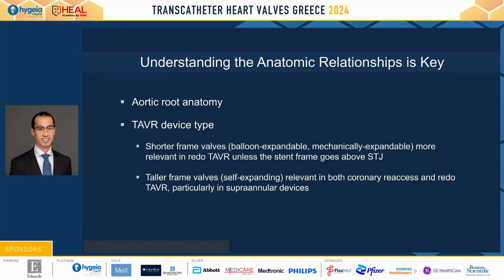The shorter frame valves will be more relevant in terms of redo TAVR than coronary access, but the taller frame valves, most of them self-expanding valves, will be relevant in both coronary access and redo TAVR, particularly in supra-annular devices.